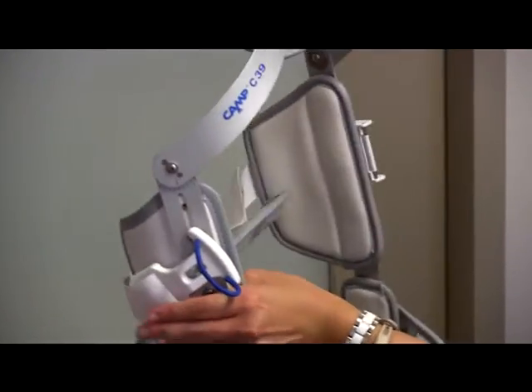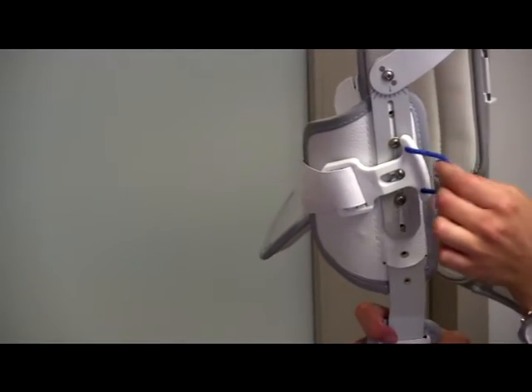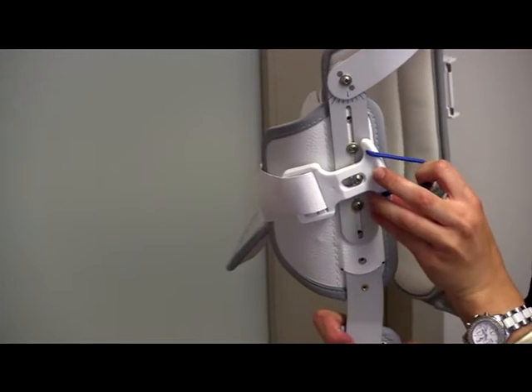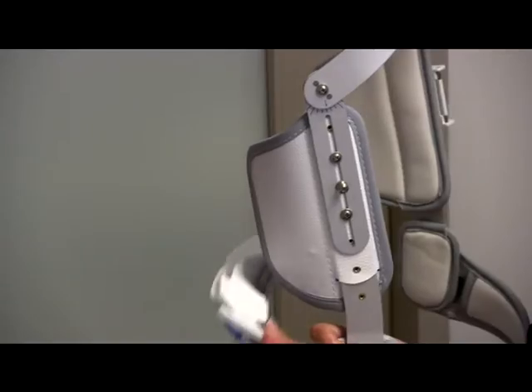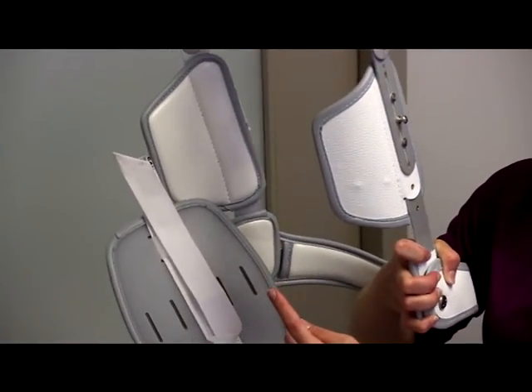Then we're going to look at the right side of the brace where this plastic piece is located with a blue string. If you pull the blue string forward, this moves the plastic piece to a bigger opening so you can lift it out and off of this raised screw located on the right side of the brace.